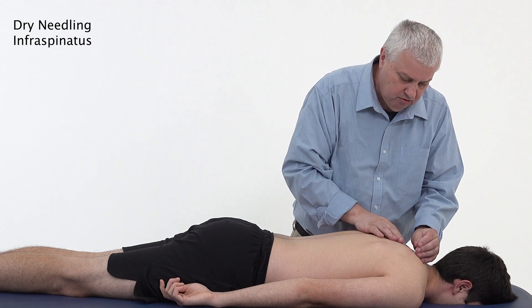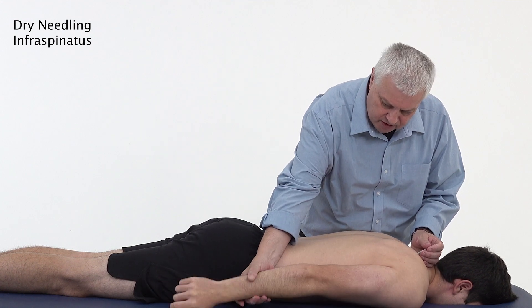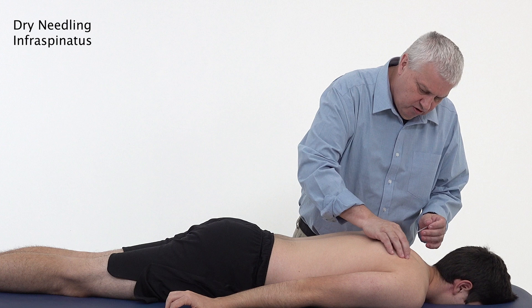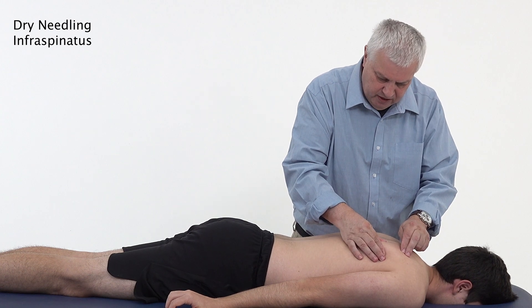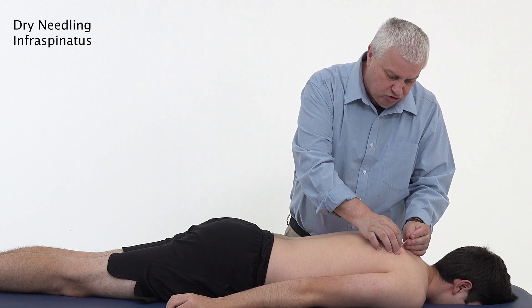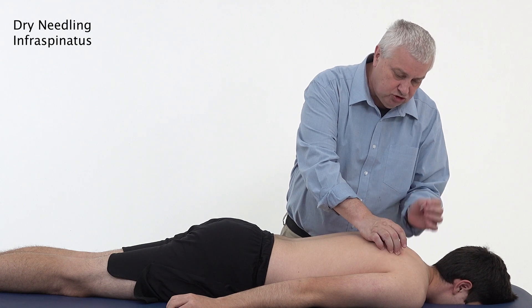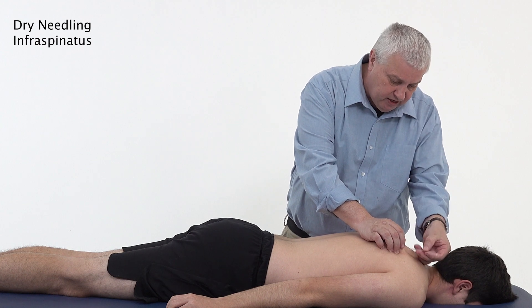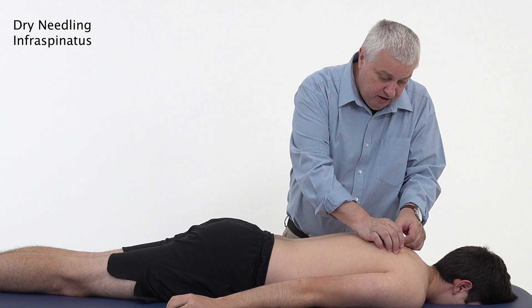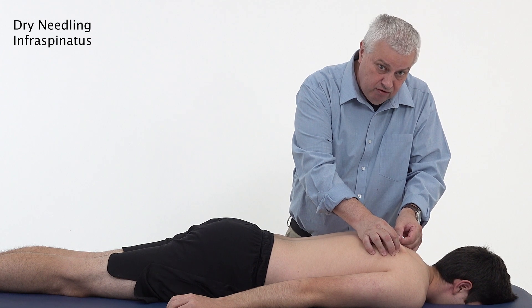Needle in a medial to lateral direction. Get the patient to turn their arm up, and when you feel the spine of the scapula with that movement, you can feel the infraspinatus. Find the trigger point, then try to grip it and lift it off the scapula, coming from a medial to lateral direction at a tangential angle. Sometimes you can go from an inferior medial or a superior medial direction, but often pincering the muscle itself and then going into it is very useful.